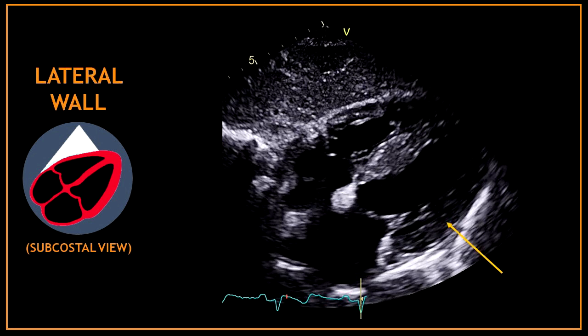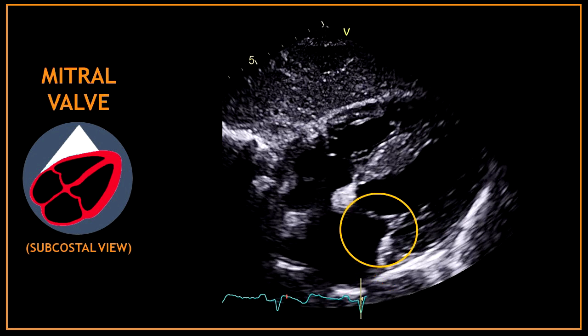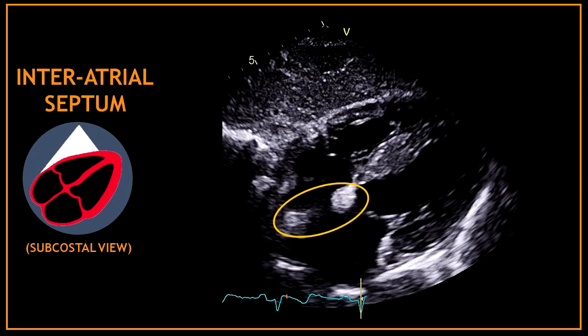More posteriorly we can assess the right ventricular lateral wall. In this view we can also visualize the left atrium. Between the left ventricle and the left atrium we can find the mitral valve. This is also a very good view to assess the inter-atrial septum.